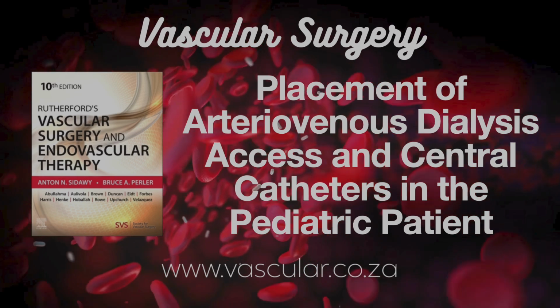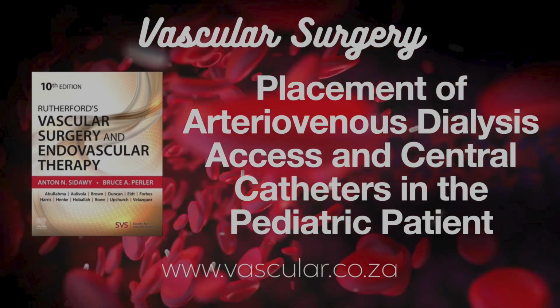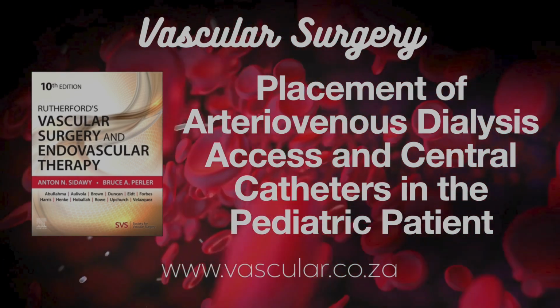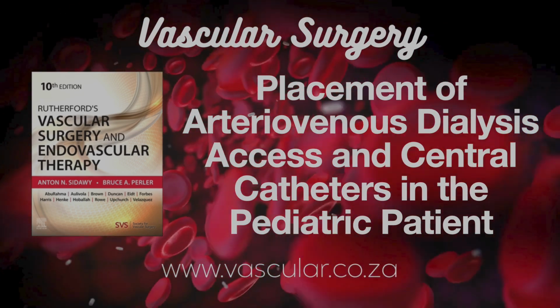And if you look at the data, like from NAPRTCS back in 2011, it showed the vast majority, like 78% of kids on HD had catheters. Only about 12% had fistula. Wow, only 12%. And disturbingly, over half of those catheters were in the subclavian vein, which we know is a major risk factor for that central vein stenosis, the narrowing.